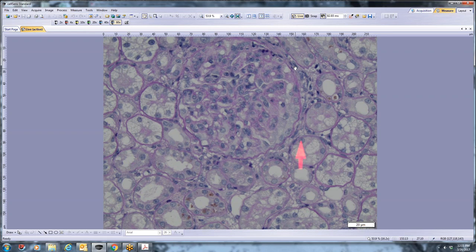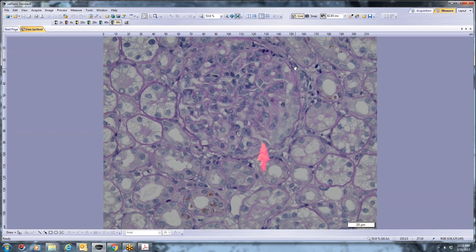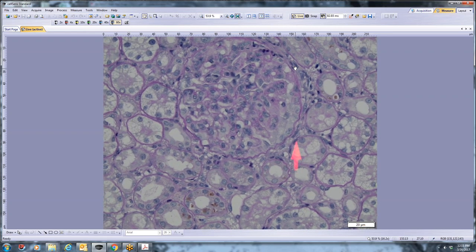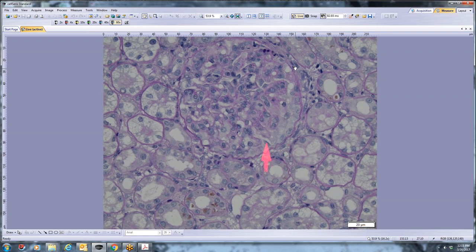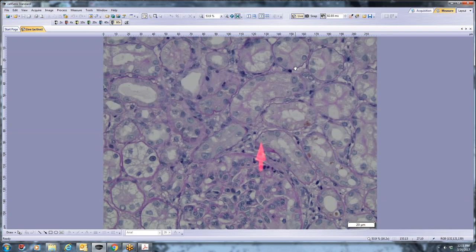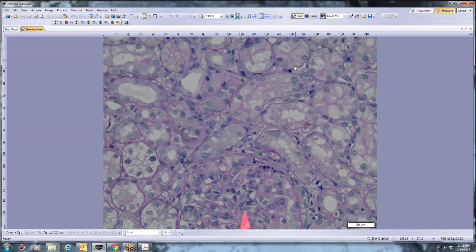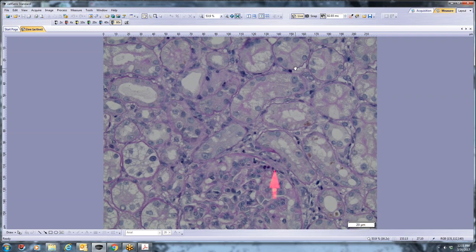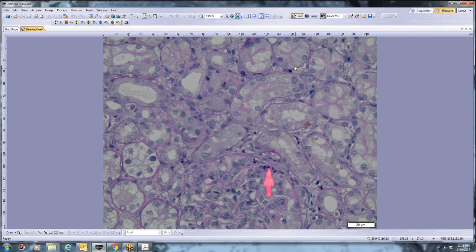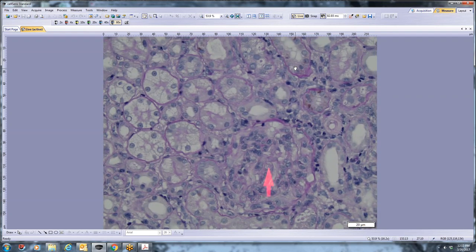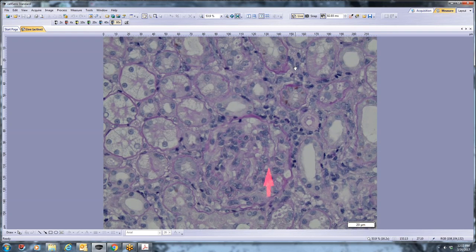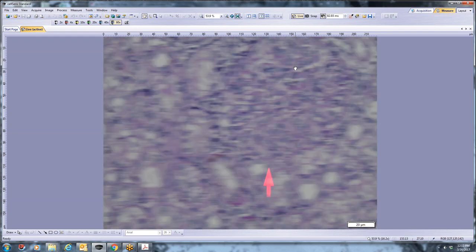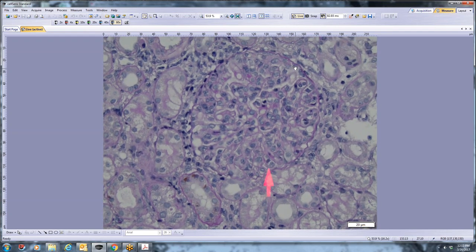There's a few areas where you could argue there's double contours. But many of the capillary walls have a normal thickness. As I teach my residents, the best thing to compare the GBM to is the TBM. So hypercellularity, there's just a bit of remodeling, but not every single capillary loop is remodeled. And we have this kind of dense nuclear debris, which is probably karyorrhexis.